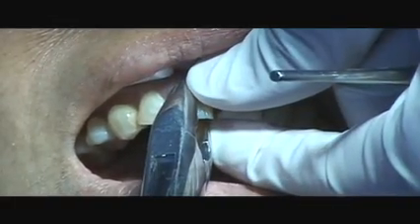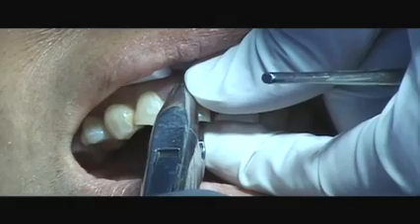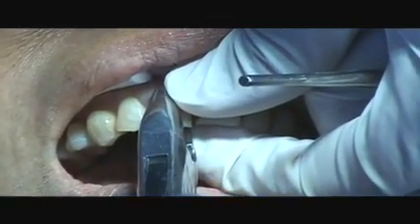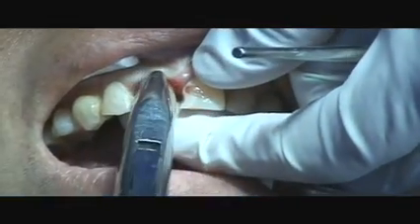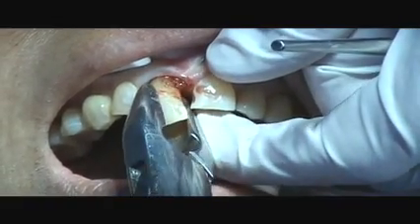The infected root canal tooth is removed gently, maintaining the integrity of the facial plate of alveolar bone. The cystic pus sacs can be seen still attached to the root surface. The alveolar socket is thoroughly cleaned of any tissue remnants.